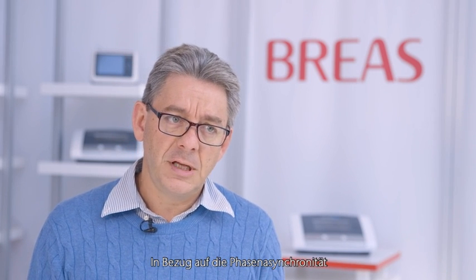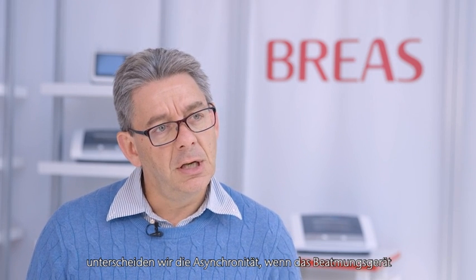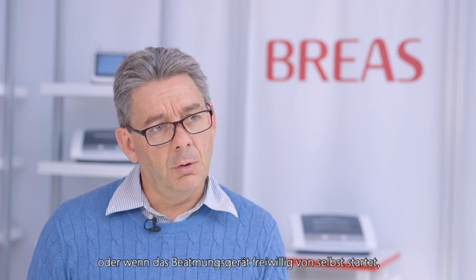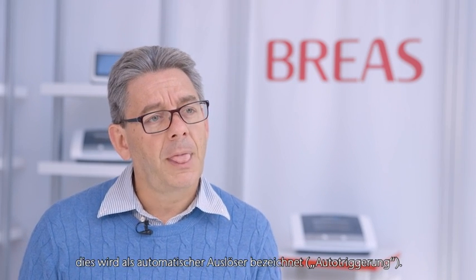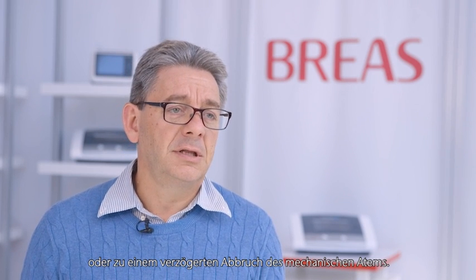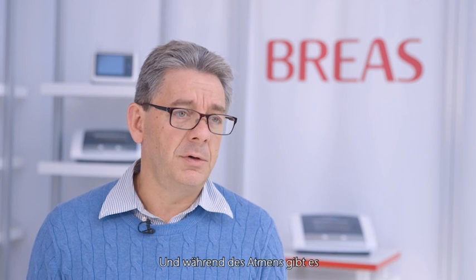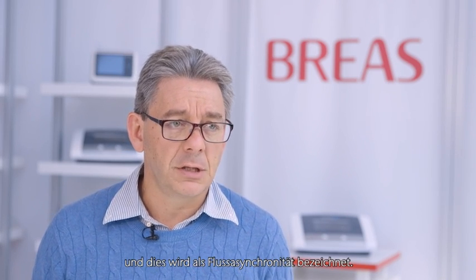So in terms of phase asynchrony, we distinguish the asynchrony when the ventilator starts later than the patient's effort, or when the ventilator starts by itself. It's called auto-trigger. At the end of the breath, there is a premature termination of the mechanical breath, or delayed termination of the mechanical breath. And during the breath, there is not enough flow or too much flow, and this is called flow asynchrony.